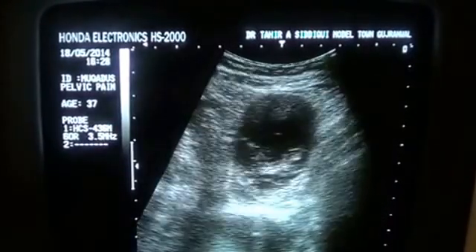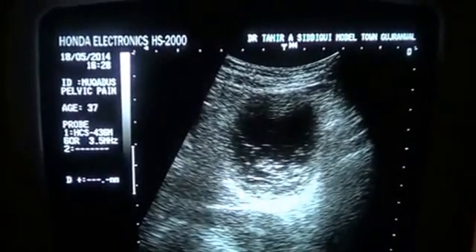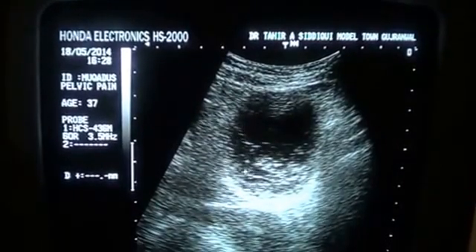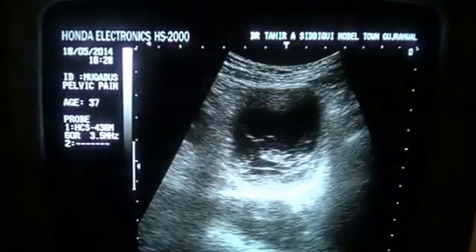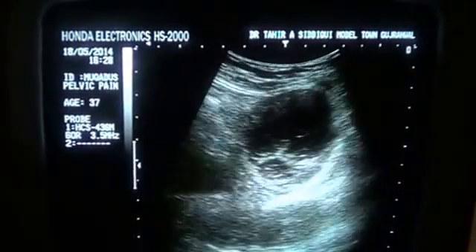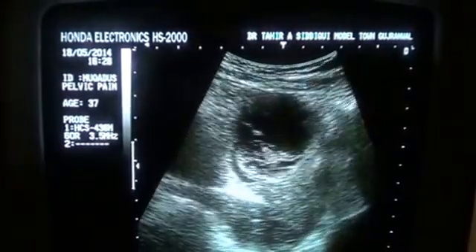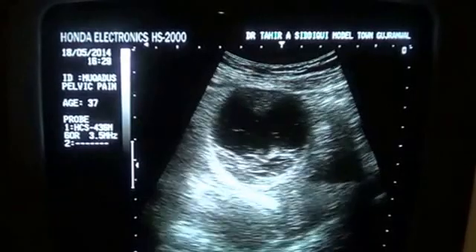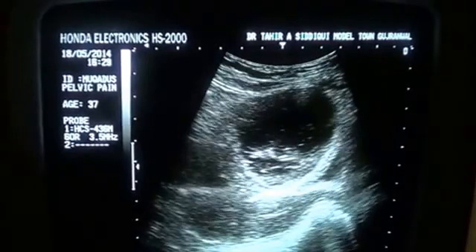Now let's study the cyst only. You can see that the posterior wall is strong. We are seeing a strong back wall. You can see the septals, thick, thin, complete, incomplete, all sorts of septals are present in it. This is the longitudinal section. Now this does not change its shape when I rotate the probe. And now I'm rotating the probe. It retains its shape, and all the material is seen in the dependent region of this cystic area anterior to the uterus.